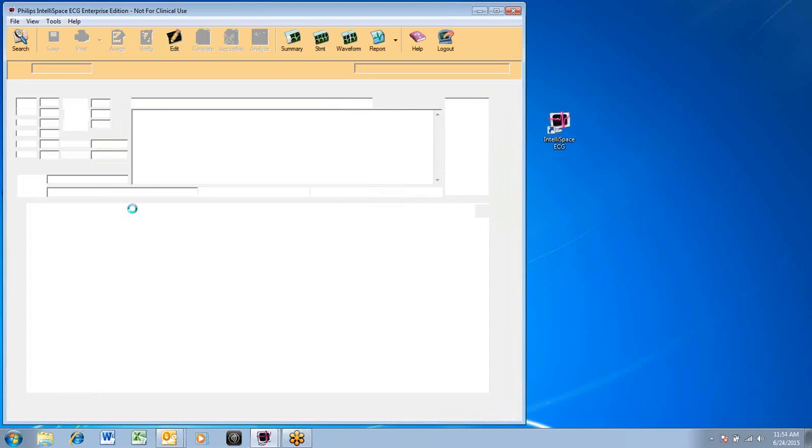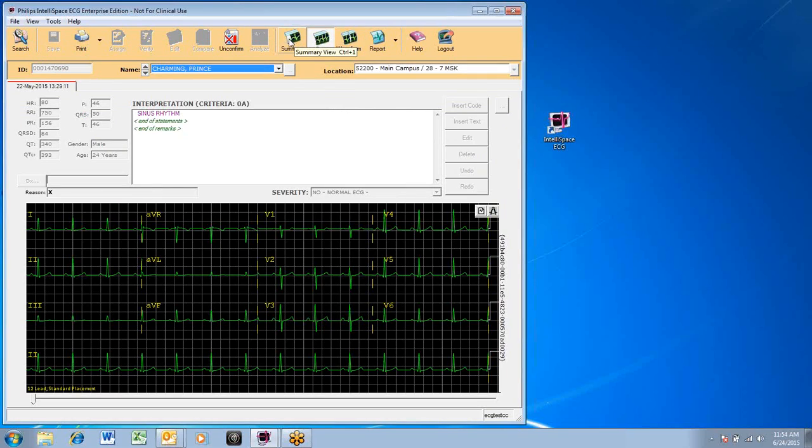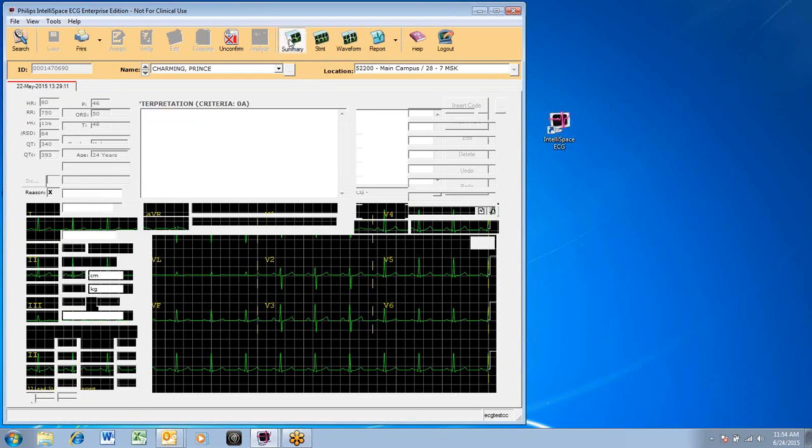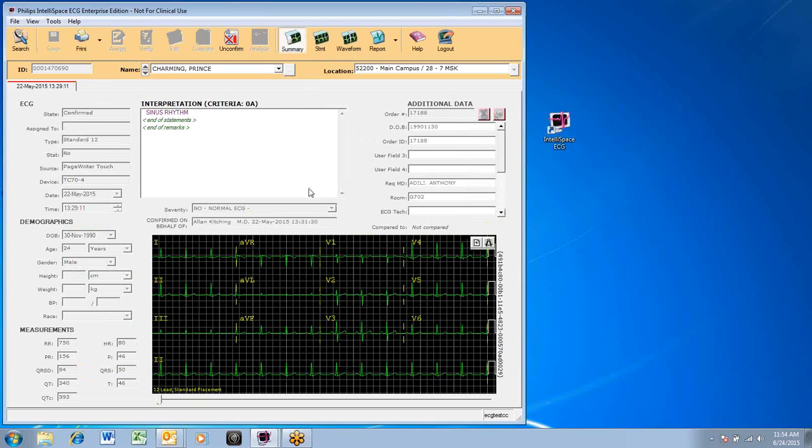There are more navigational buttons on the top of the screen. The summary button displays the patient demographics for the chosen ECG, the confirming cardiologist, the measurements, and interpretation.